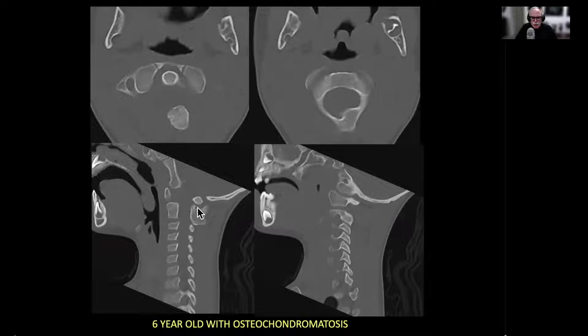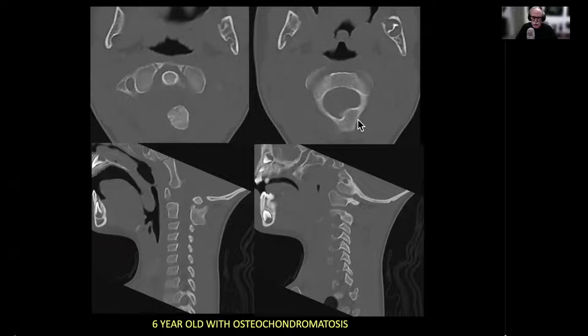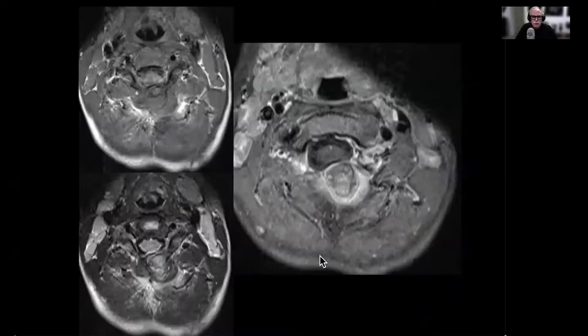Here, pretty simple and straightforward. I've got a lesion that looks almost like normal bone — cortical continuity that all looks very well defined, and the overall trabecular pattern of the bone itself is also normal. Again, the internal characteristics are normal. Nice corticated features, a little of an expansile lesion. So, osteochondroma.